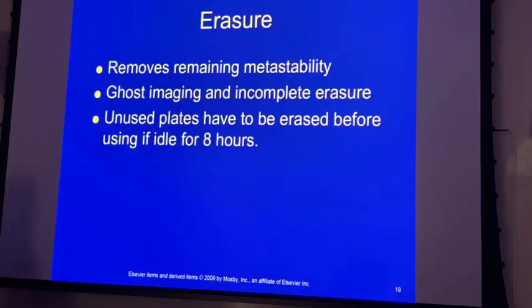Question? Is there ghosting or anything possible on DR? On DR, yeah, actually there is, and it usually occurs at very, very low exposures, and it's almost an anomaly sometimes. We had it yesterday. Did you? Me and the tech were really confused by it, because my marker showed up in a place where it wasn't. It must have been a ghost. You could see my marker on the image where I actually had it, and then you could see where it was from maybe an image earlier. We had to repeat it because it was right in the area. It was really weird. I told her I didn't know that could happen on DR.